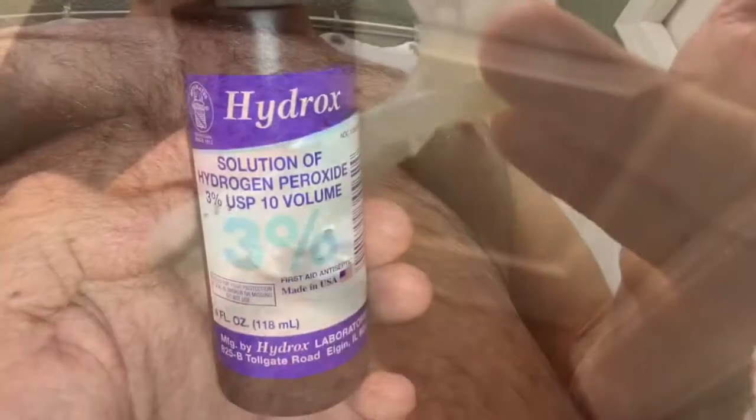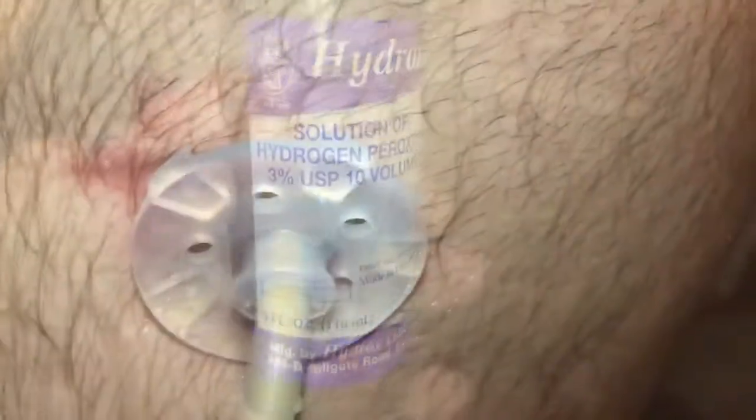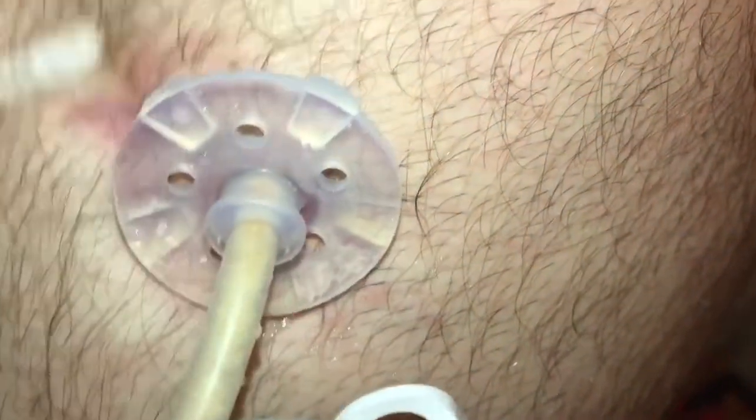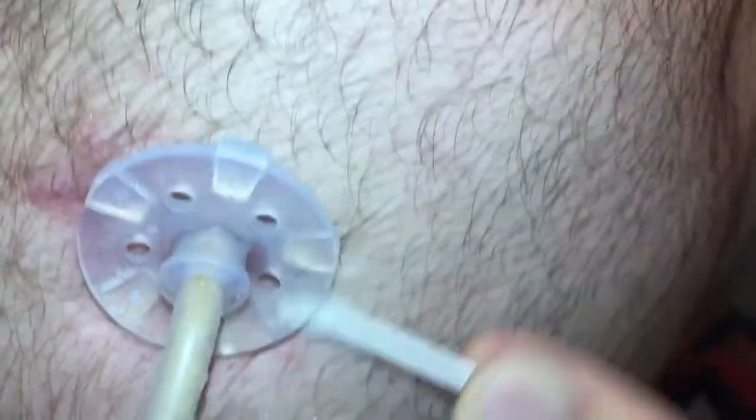this PEG tube. And then I use a solution of hydrogen peroxide, which is only 3%. And using my Q-Tip with hydrogen peroxide, I just clean all around it on both sides. And as you can see, after a shower, everything is nice and clean on my tube.